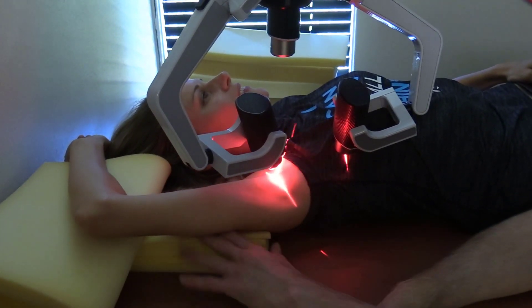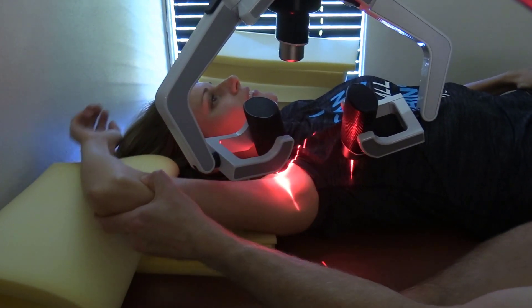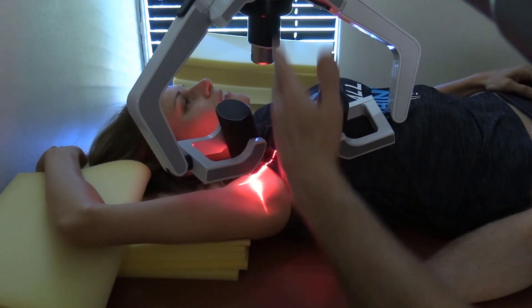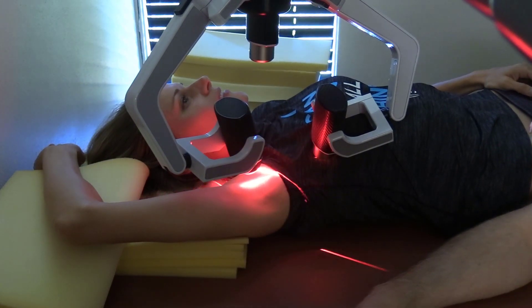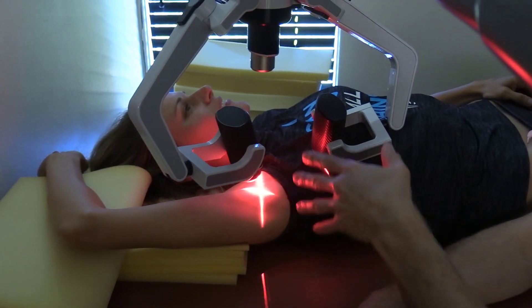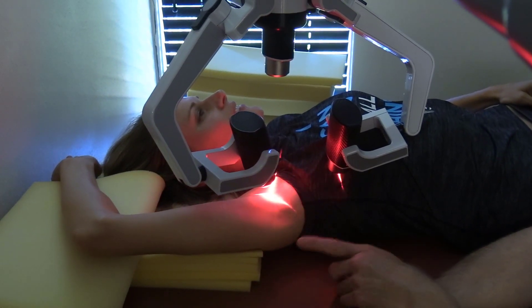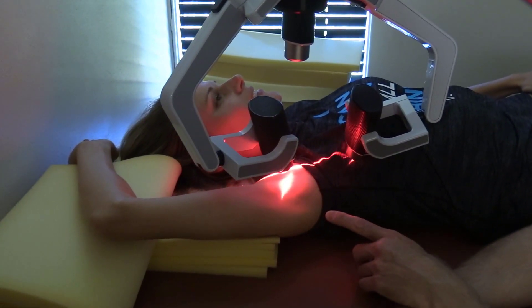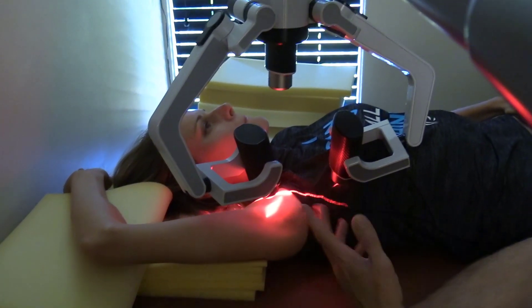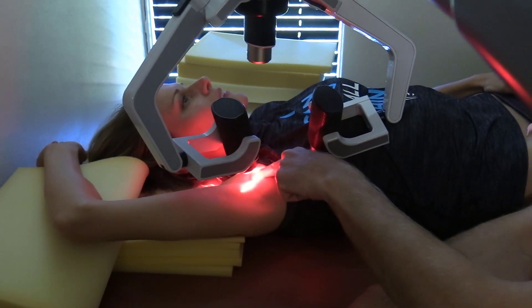This position is important — she's resting her arm with a little bit of buffer up here. Some people wouldn't be able to get their arm down that low; I've had some people struggling just to even get it vertical. They can hold on to the laser system to help support it, and you can still get the laser energy in there. The critical spot is if they're having numbness and tingling in their arm — tingling, numbness, pain shooting down the arm can be from entrapments in the neurovascular sleeve right up here.